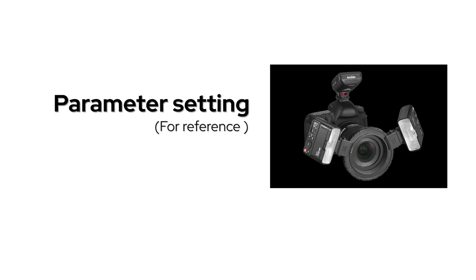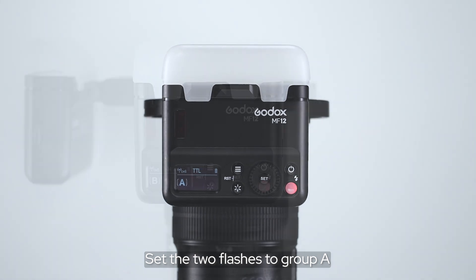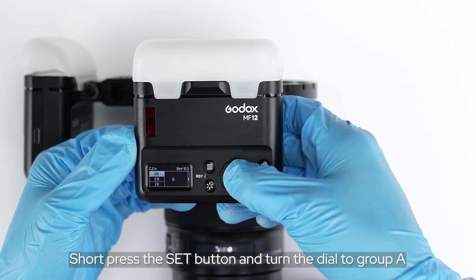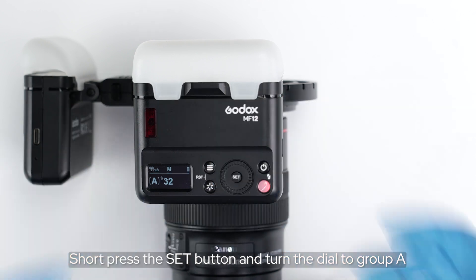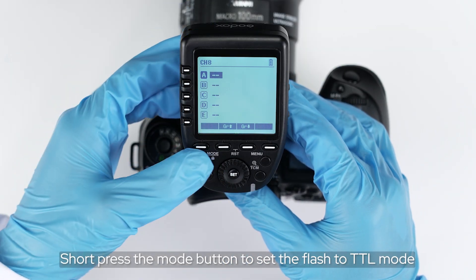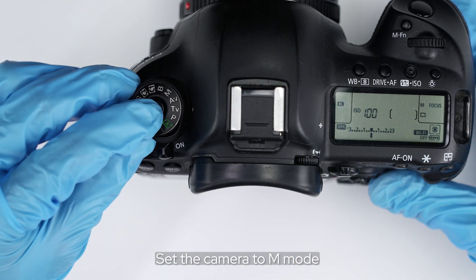For parameter settings, set the tool flash to group A. Short press the menu button, turn the dial to GR, short press the set button, and turn the dial to group A. Short press the group A button. Short press the mode button to set the flash to TTL mode. Set the camera to M mode.